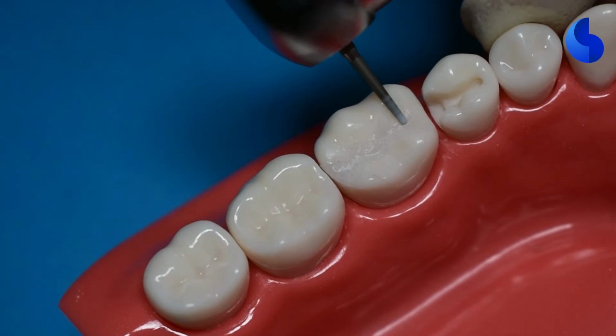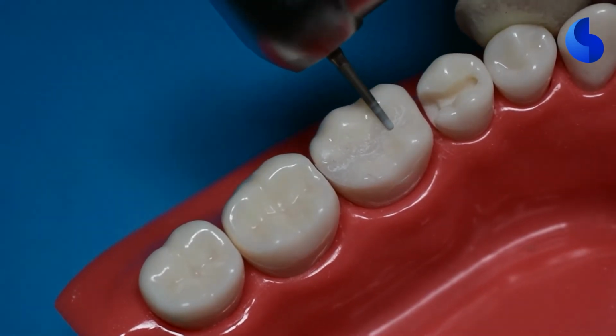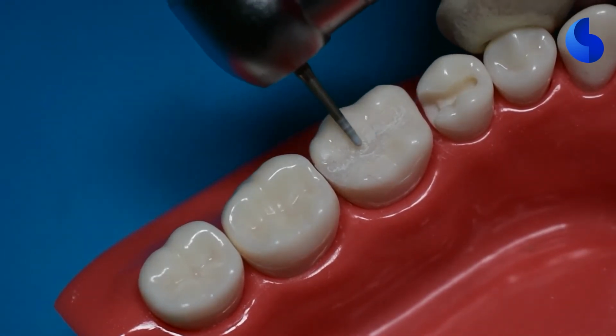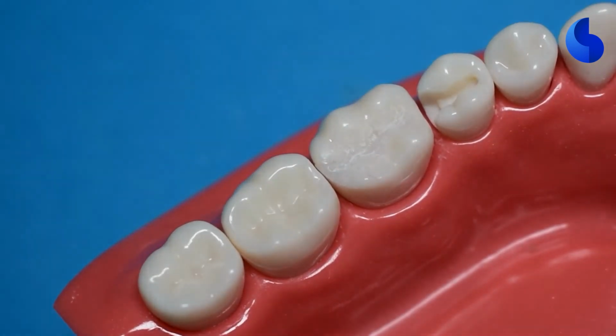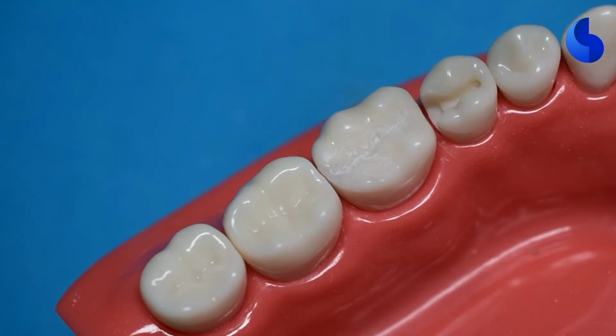All the time, be careful that you're not removing any additional material. Don't try to create any ditch. And try not to place your diamond on the tooth structure, because that would create some scratches that you don't want to have.